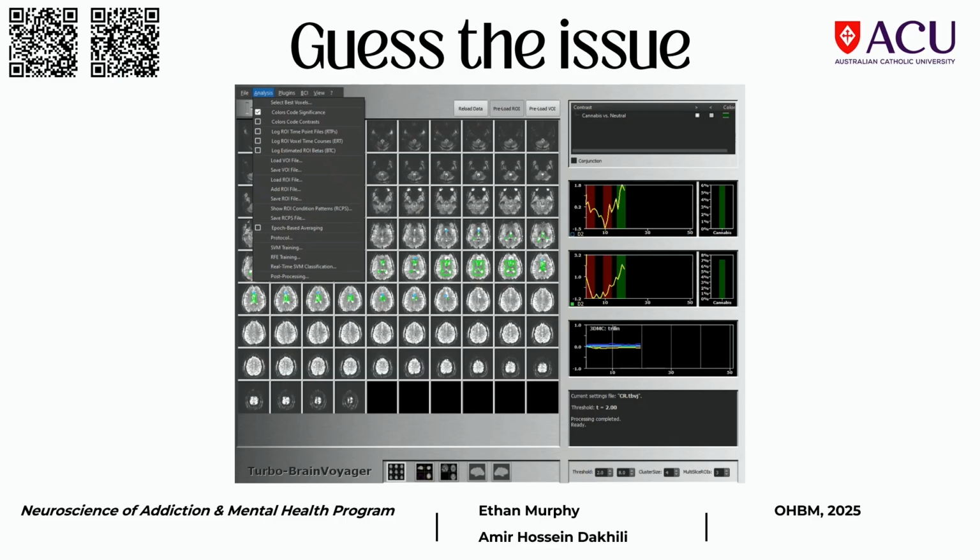Yeah, this isn't a video, but can anybody guess? First of all, is this going to run? Will this neurofeedback?